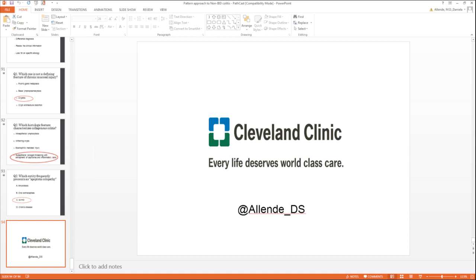So I didn't give up on the case. I sent out the case to another lab, which had a different antibody for adenovirus, and the immuno came back positive. We confirmed that diagnosis clinically. So one word of caution for adenovirus and antibodies: there are many different serotypes, and the antibodies commercially available have different combinations of serotypes. We obviously changed our own antibody after this case was discovered, because we realized the antibody that we were using was not capturing certain serotypes. So it was a good learning experience for us.